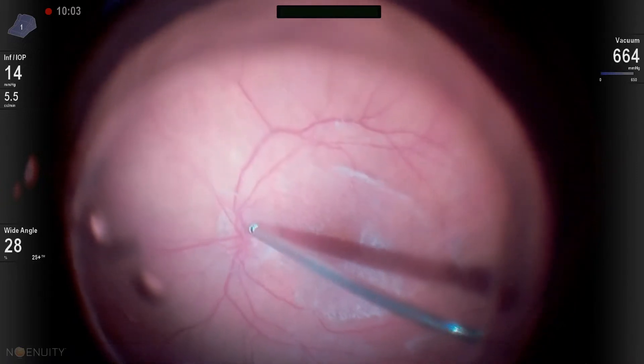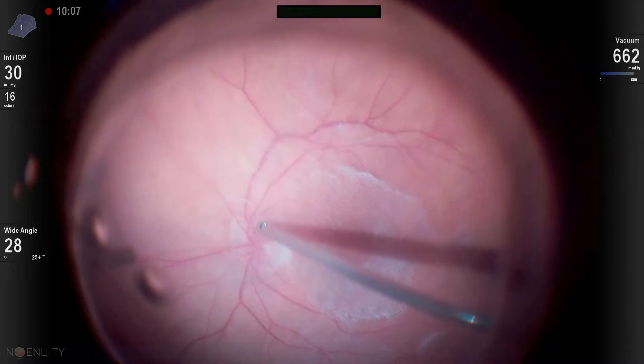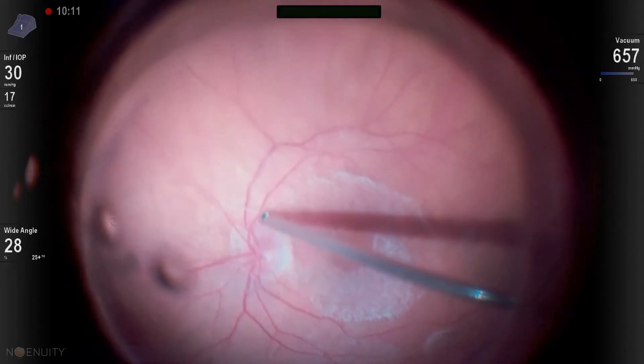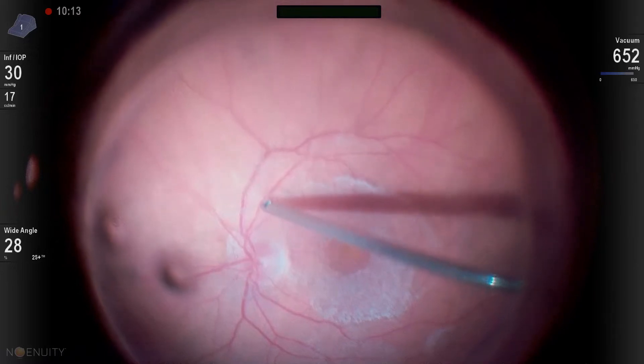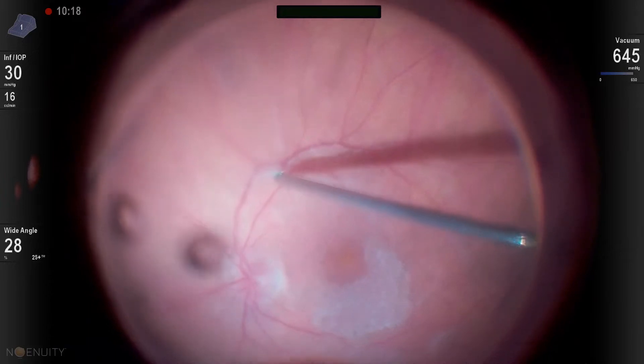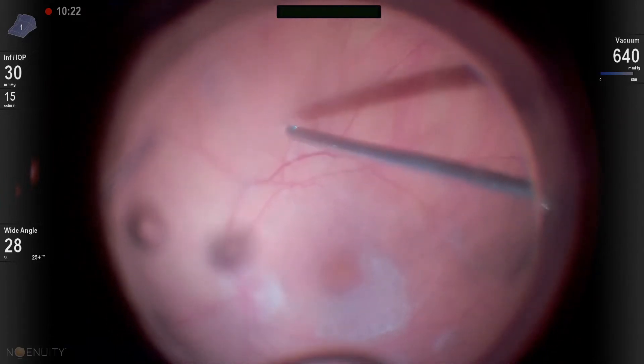You really want to start over the optic nerve head. Try to peel at either the superior or inferior edges. Make sure you have your vitreous cutter occluded and keep the cutter tip down close to the retina as you're peeling out. You're really trying to shear that vitreous off of the optic nerve head against itself.